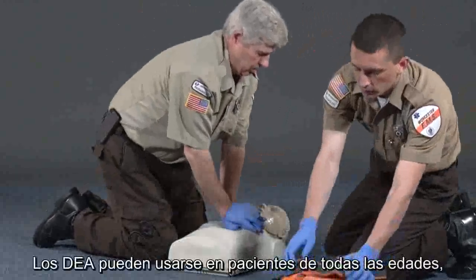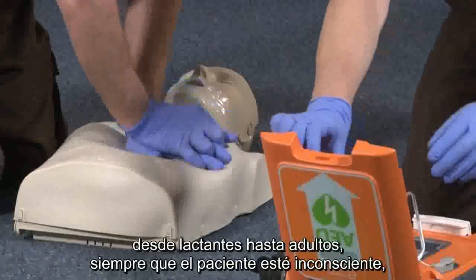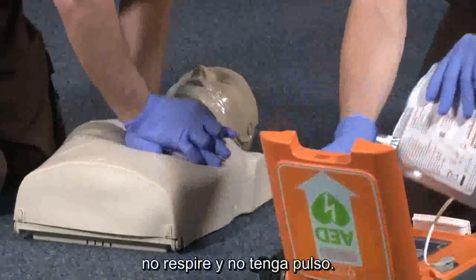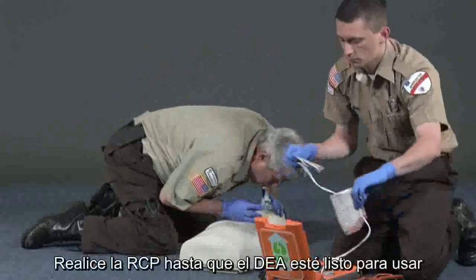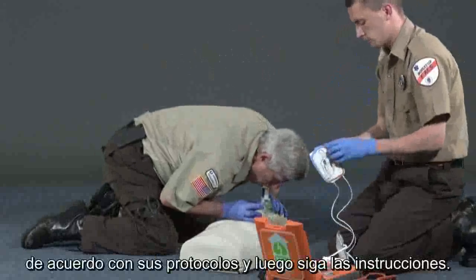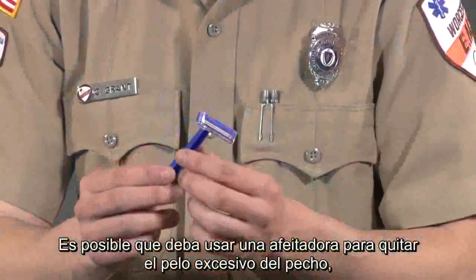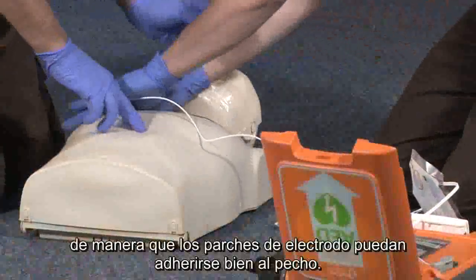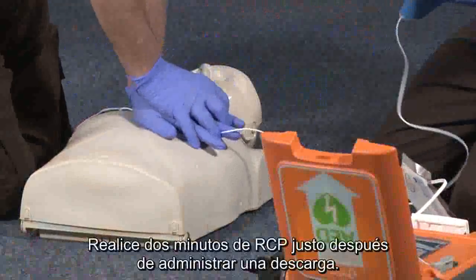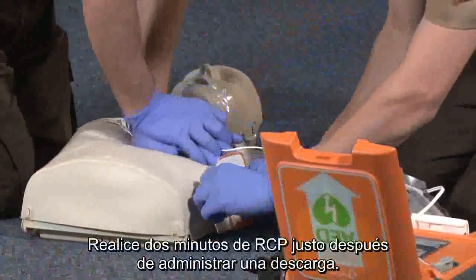AEDs can be used on patients of all ages, from infants to adults, as long as the patient is unresponsive, not breathing, and without a pulse. Perform CPR until an AED is ready to be applied according to your protocols, and then follow the prompts. It may be necessary to use a razor to remove excessive chest hair so that the electrode pads properly adhere to the chest. Perform 2 minutes of CPR immediately following the administration of a shock.